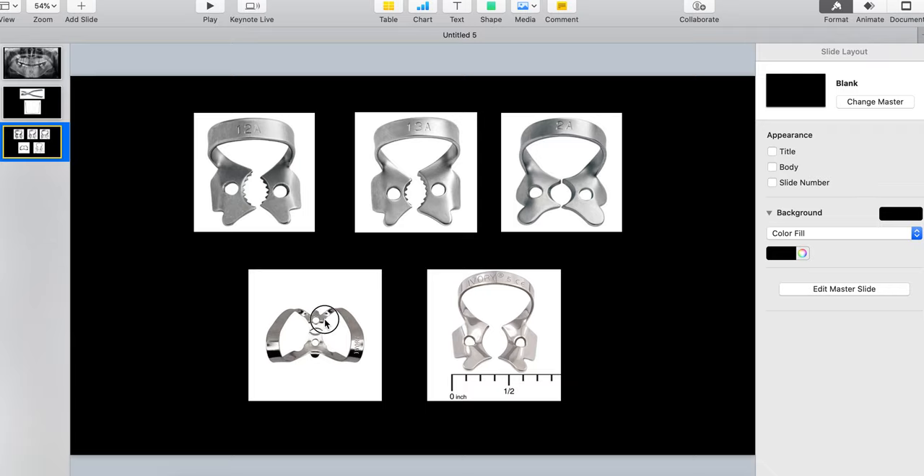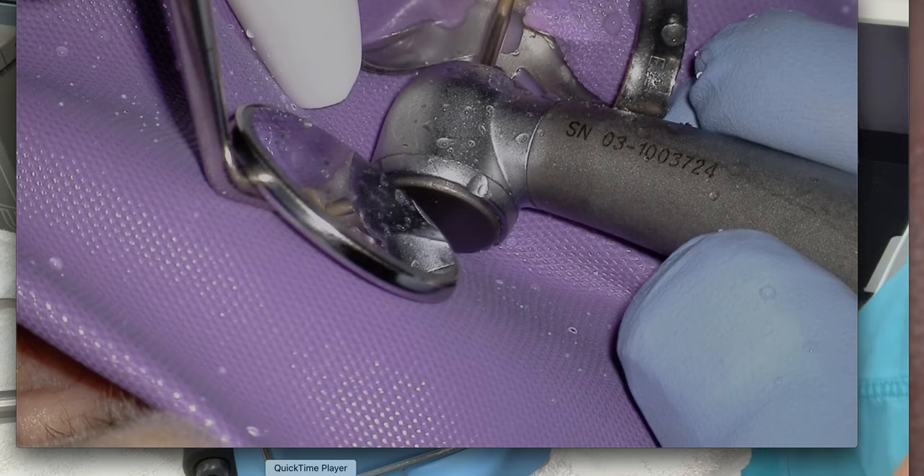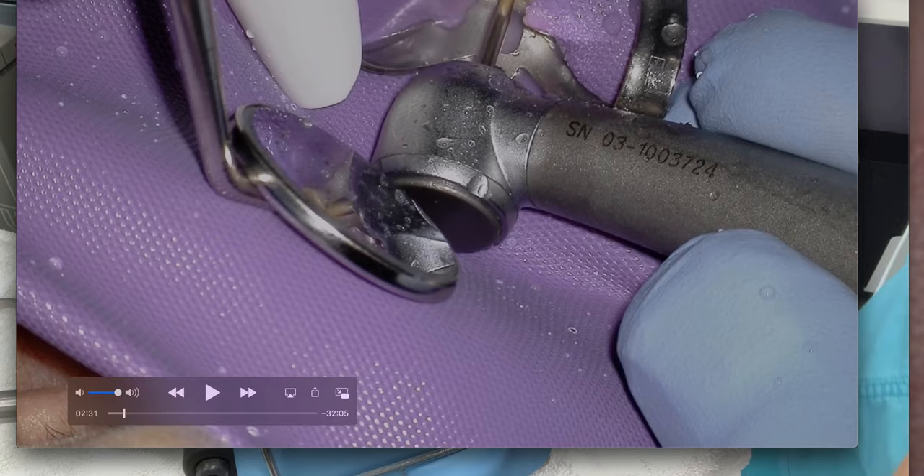When looking at rubber dam clamps, what I was taught is to use the 12a. I think about this every time: if I'm in quad 2 or quad 4, I need a 12 — there's a 2 in the number, and they're even-numbered quadrants. If I'm in quad 1 or 3, I use the 13 clamp — a 1 and a 3. The beauty of these winged clamps is that you can place the rubber dam and the frame all at the same time.